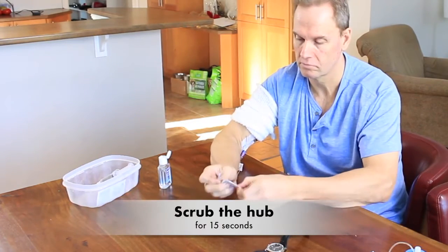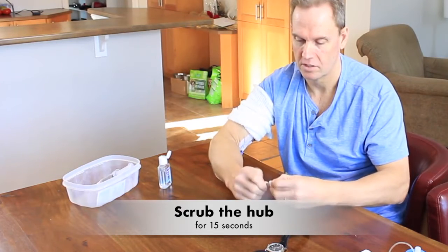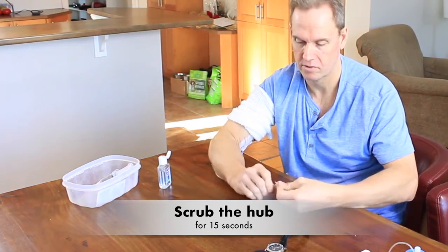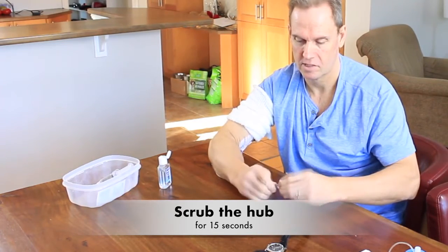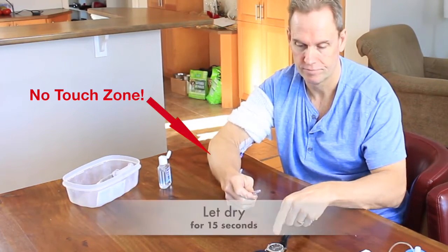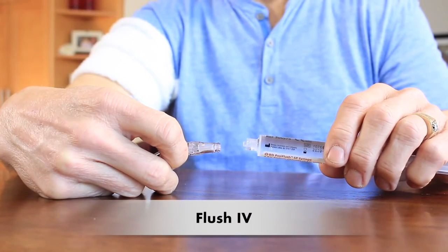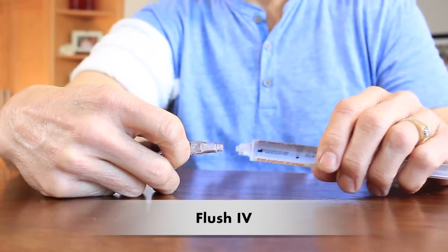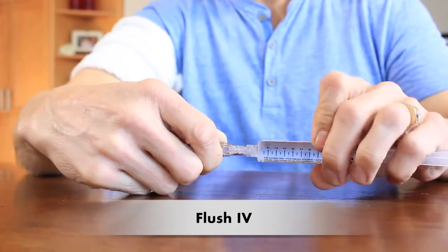In our area, we use two flushes, so you need to scrub again. So take your alcohol or chlorhexidine swab and scrub the end and the sides for 15 seconds with a good scrub. And then, of course, you have to let the alcohol kill any germs, so let it dry for 15 seconds. You're ready to attach your flush, so push it on and then twist it onto the cap.